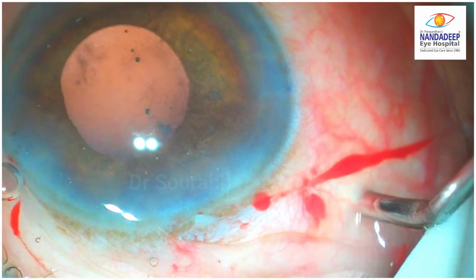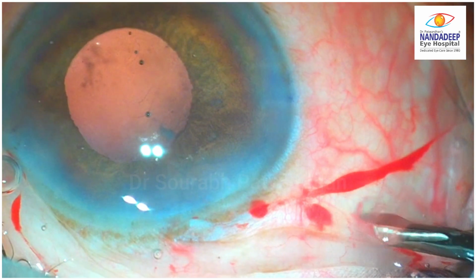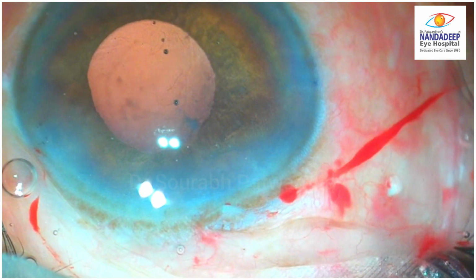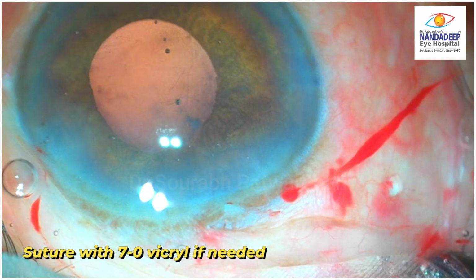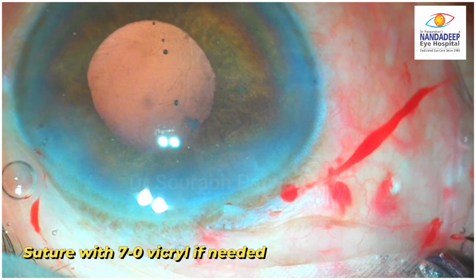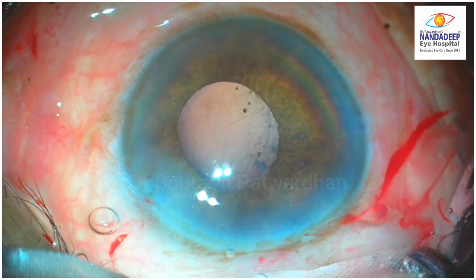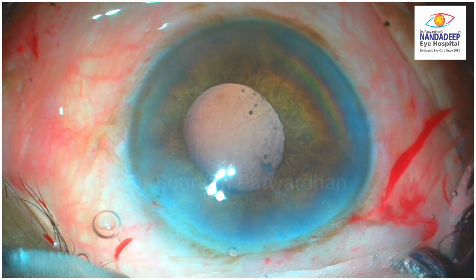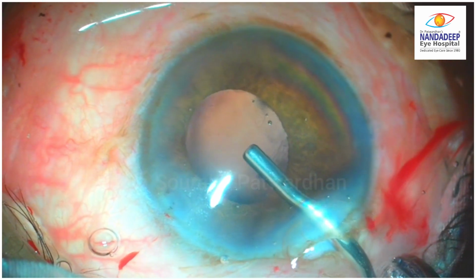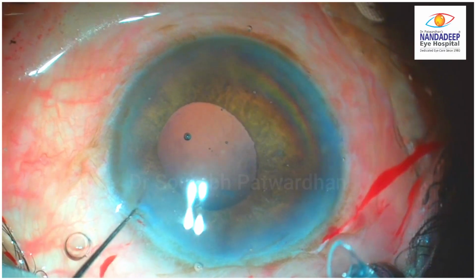And generally the Berger space is bulging a lot, so usually it will rupture and it will clear the fluid through this pars plana. If required, you can suture this with 7-0 Vicryl, but mostly there will not be any vitreous incarceration in such a small incision. And this is done at around 3.5 millimeter from the limbus. And once you do this, you will find that now the anterior chamber can be deepened easily with OVD, because now there is no fluid in the Berger space.